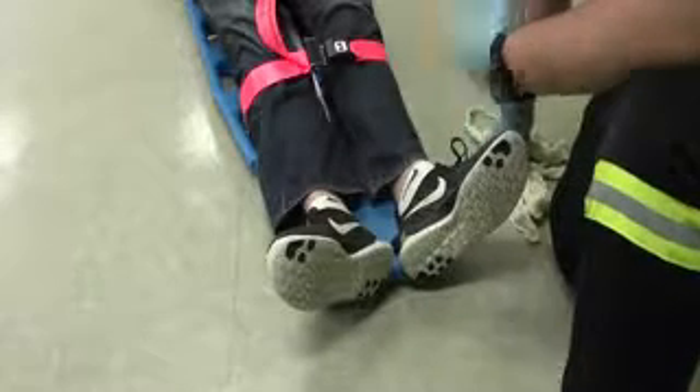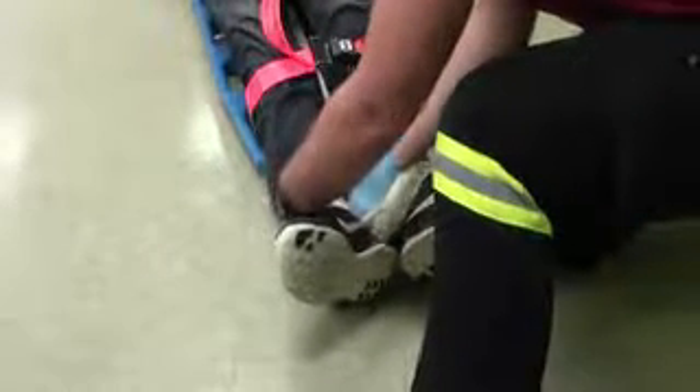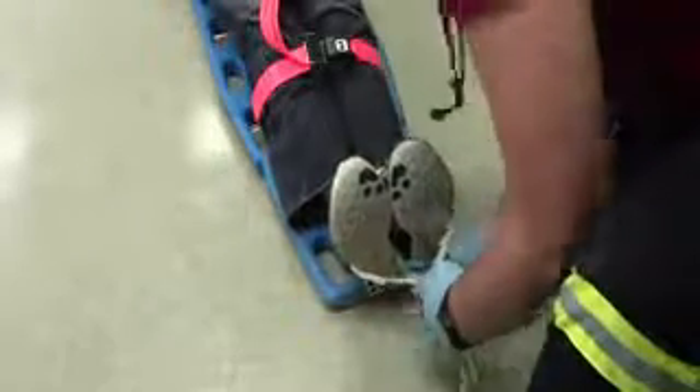And this is how you properly figure-eight the patient's feet together. Behind each leg, an even amount on each side, criss-cross it, and tie it underneath the feet.